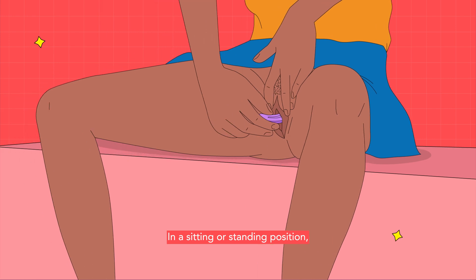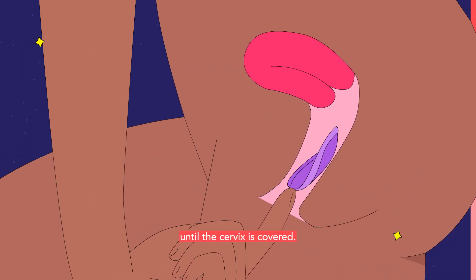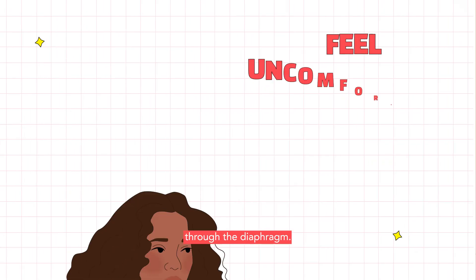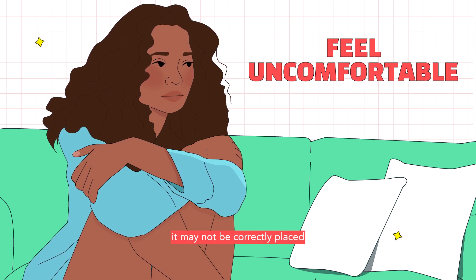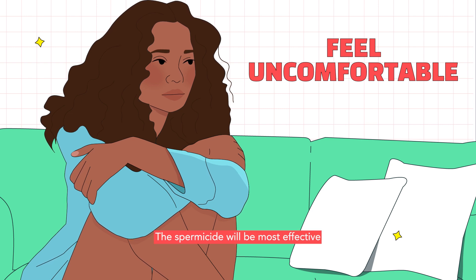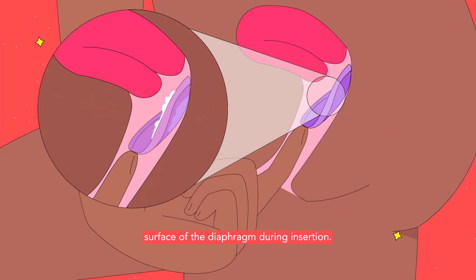In a sitting or standing position, spread your legs and separate the outer lips of your vagina. With one hand, push the diaphragm as far up into your vagina as you can until the cervix is covered. If it is placed correctly, you should be able to feel your cervix through the diaphragm. If you feel uncomfortable after insertion, it may not be correctly placed and you should try reinserting it. The spermicide will be most effective if it stays on the inner surface of the diaphragm during insertion.